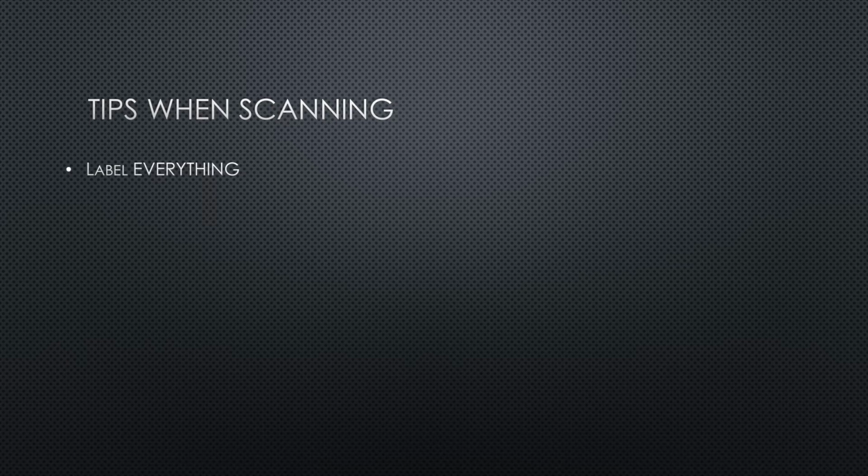Whereas sometimes you have ones like an abscess. Okay, well, what's the location of the abscess? Because that changes a lot of other factors as well, right? Make sure you take your time. Be really patient and methodical, especially if you're scanning independently, because you guys are just learning, right? Generally speaking, maybe not everyone, but most of us are just learning. Some of us are continuing to learn over time, but you're still learning. So it is okay for you to take an ultrasound that lasts 5, 10, or 15 minutes in a stable patient. That is totally fine because you are learning how to do this properly.